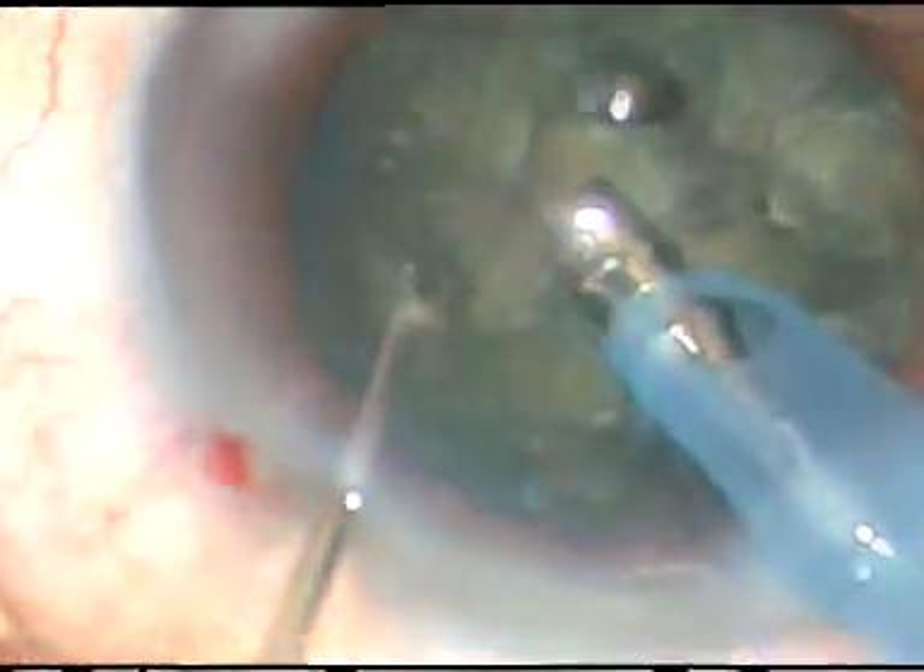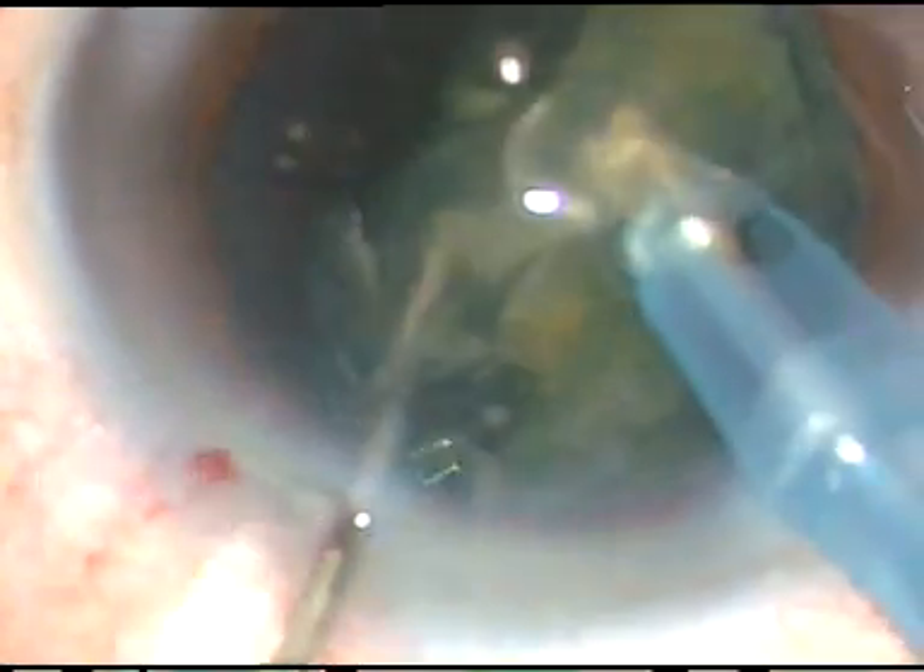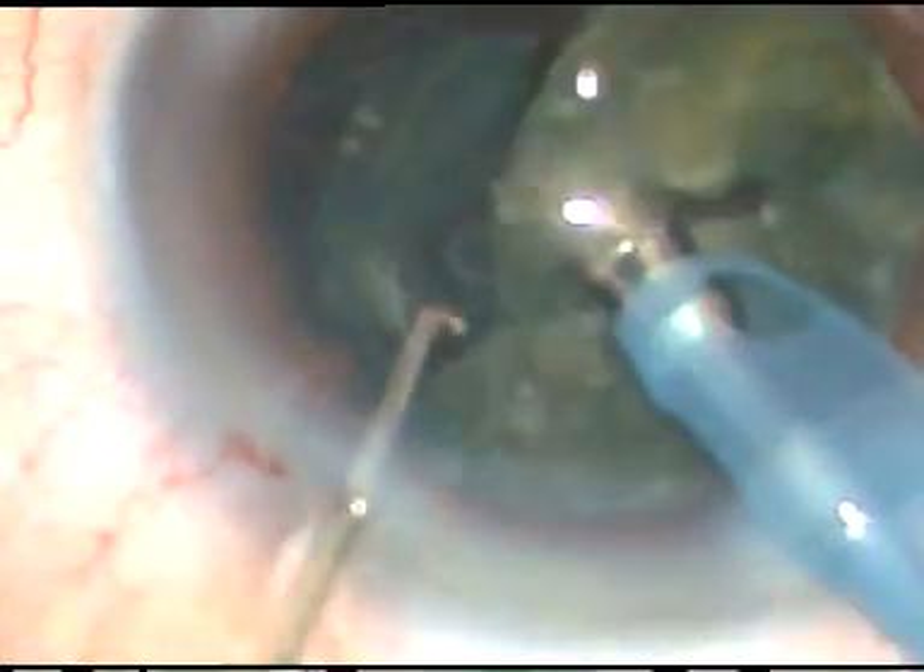This is the first case. By this time the nucleus has been chopped into several fragments, and some fragments have been emulsified and taken out.